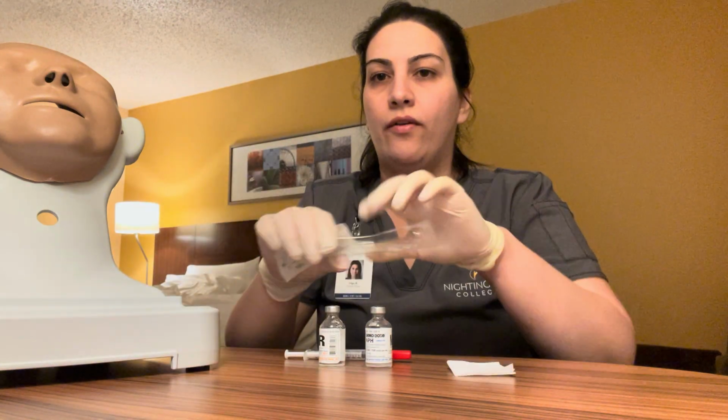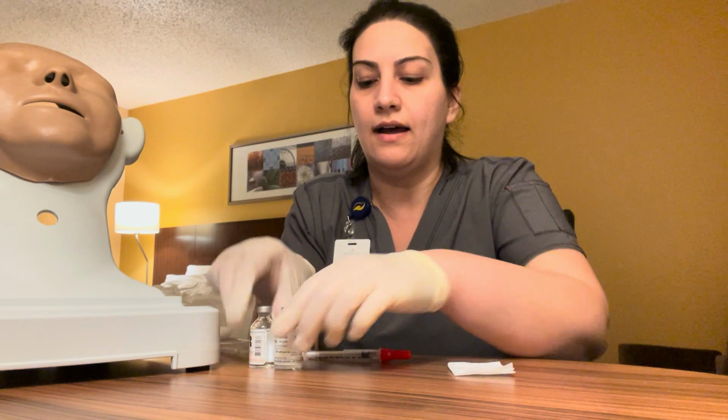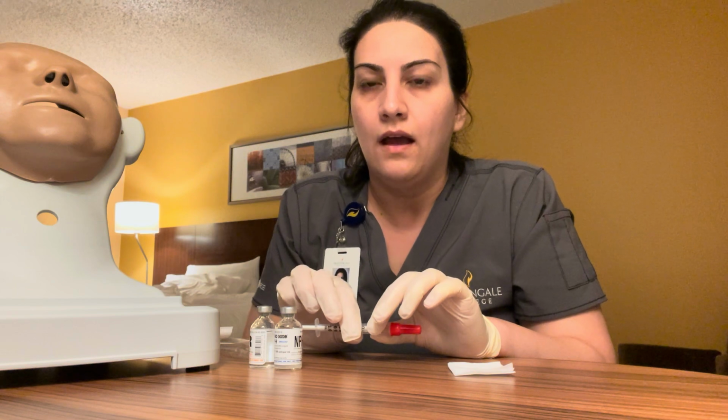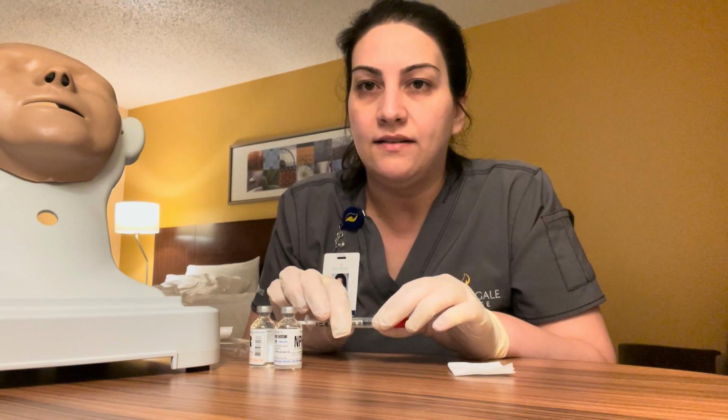As I have all that prepared, if I was going to get this ready away from bedside, I would label the patient's name here and the dosage amount and document my results.